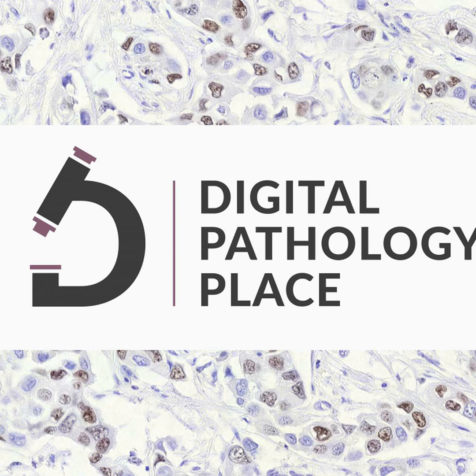Because when you are teaching pathology, you are trying to show people slides, and when you are trying to show them slides, they have to be in the room. You're showing them on a microscope and pointing out features to them, and that is how they learn the best, either on a two-head scope or a multi-head scope. And with digital pathology, they did not have to be in the room. They could be in another hospital, and we could still show them the same features on the slide through the computer and the cloud.